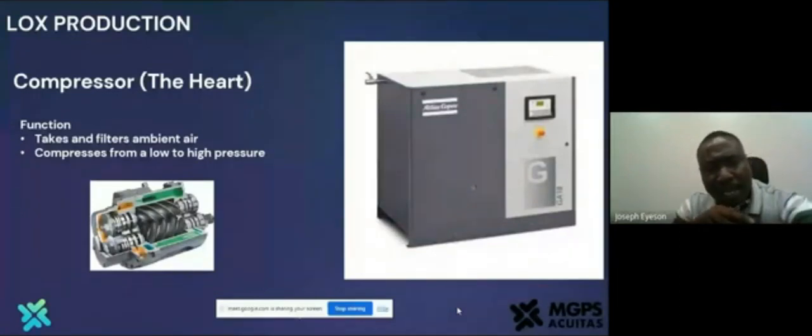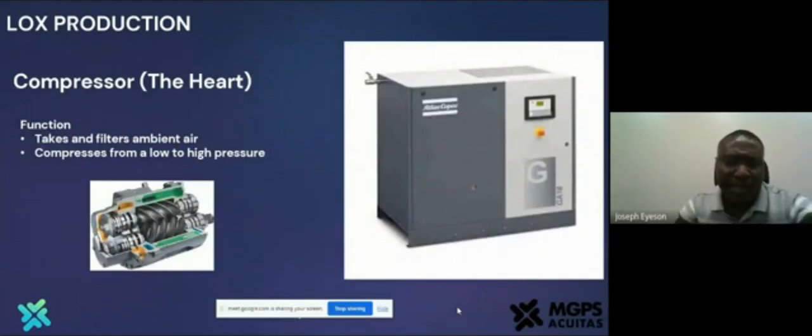Why? Because there is oil around them. They are normally flooded in it for lubrication and also to cool the air that you are compressing. So mainly when the compression is done, some of this oil is carried along with the air.